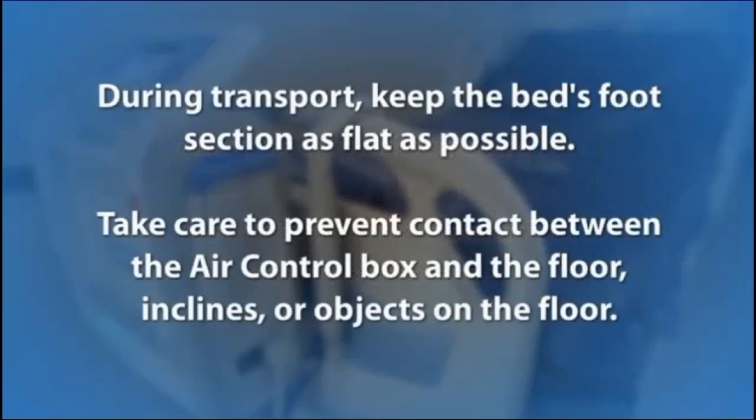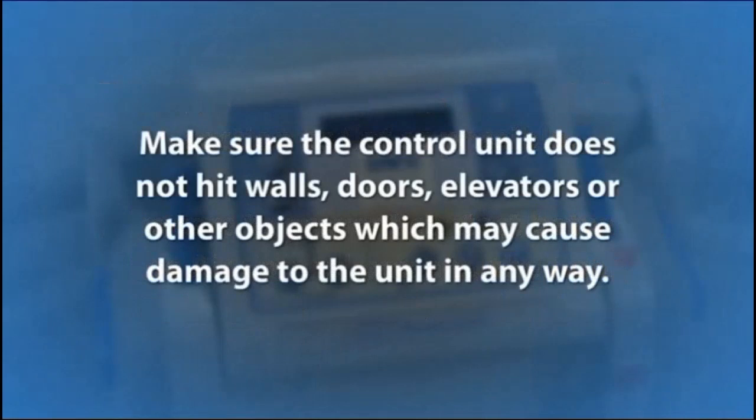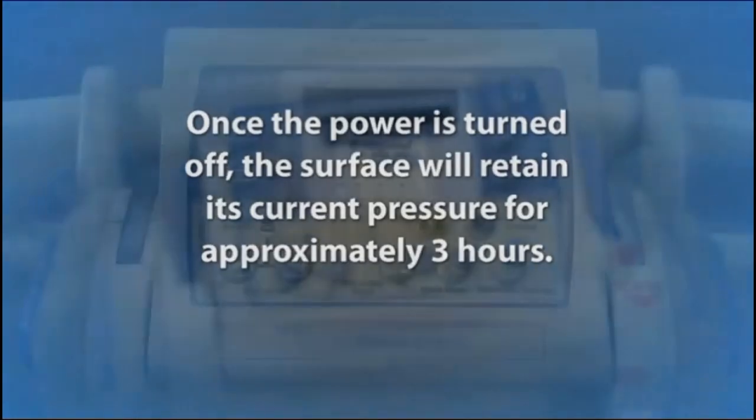During transport, keep the bed's foot section as flat as possible. Take care to prevent contact between the air control box and the floor, inclines, or objects on the floor. Make sure the control unit does not hit walls, doors, elevators, or other objects which may cause damage to the unit in any way.